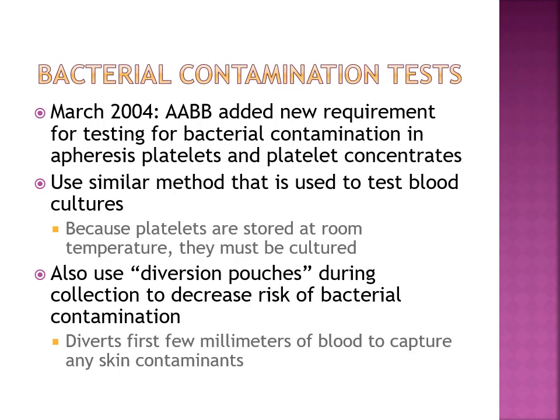So finally, we have bacterial contamination tests. In March of 2004, the AABB added new requirements for testing for bacterial contamination in apheresis platelets and platelet concentrates. This uses a similar method as used to test for blood cultures. This is because platelets are stored at room temperature. They must be cultured in these blood culture bottles because bacteria love to live and propagate at room temp.